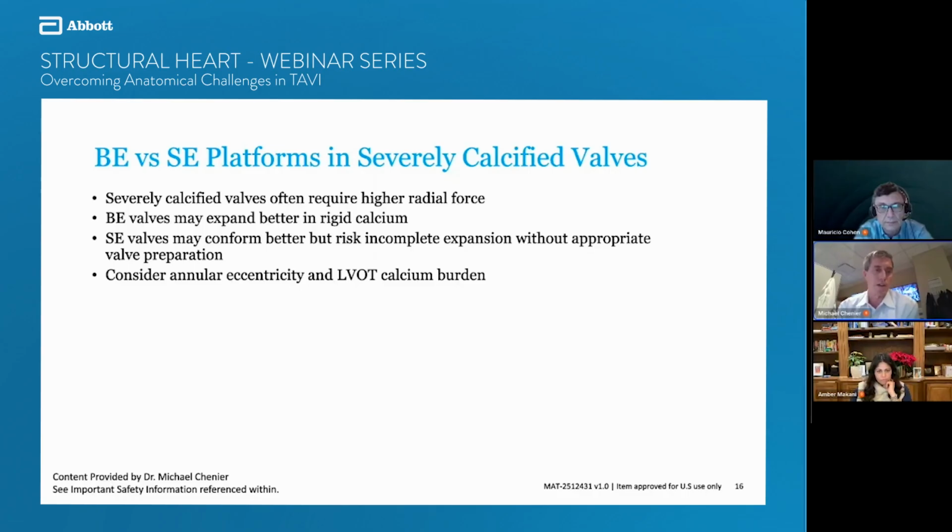I think the other thing that I would note is when the valve itself is severely calcified and your angle is bad, if you're choosing a different wire in order to support your system, usually that's going to be a stiffer wire, right? And if you're putting that into the left ventricle, then you obviously have a very dreaded complication rate that goes up, and that's the LV perforation because of those stiff wires. So for severely calcified valves, we have to think about that in and of itself. That feature is actually going to increase our potential for vascular complication risks inherent to passing the equipment across there.